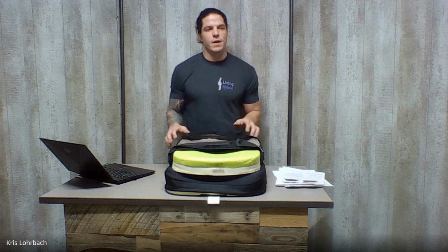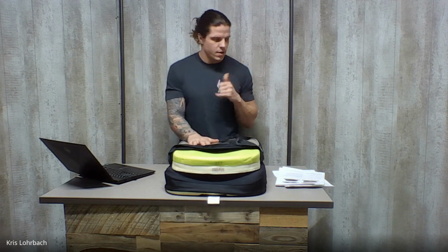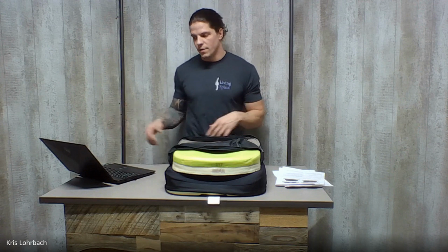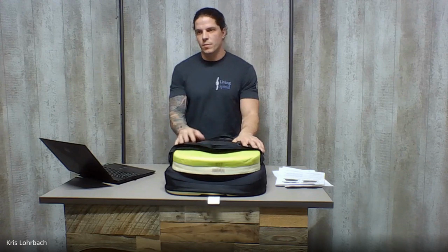So if somebody gets a cushion, they're sitting in it, and they call their ATP and say, hey, I'm having problems, I'm leaning over to one side. The ATP can come out there and shave a piece off and fix the problem. You can't do that with gel or fluid or air. So foam is very modifiable. That's why people tend to like that.